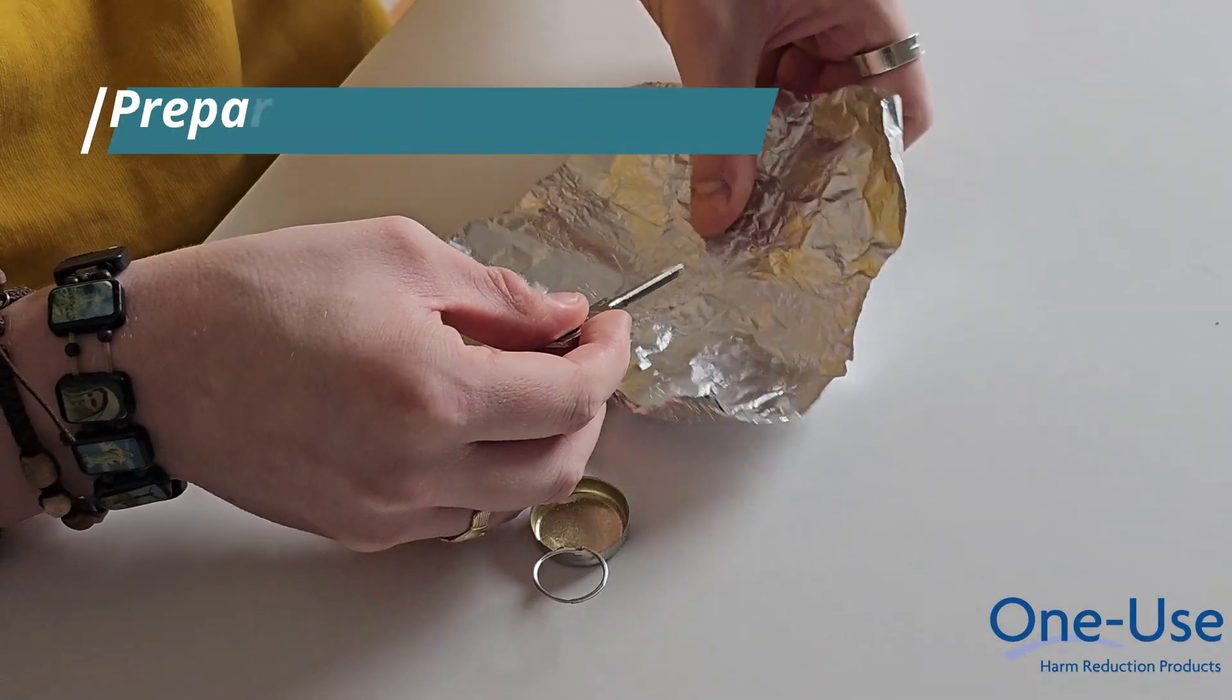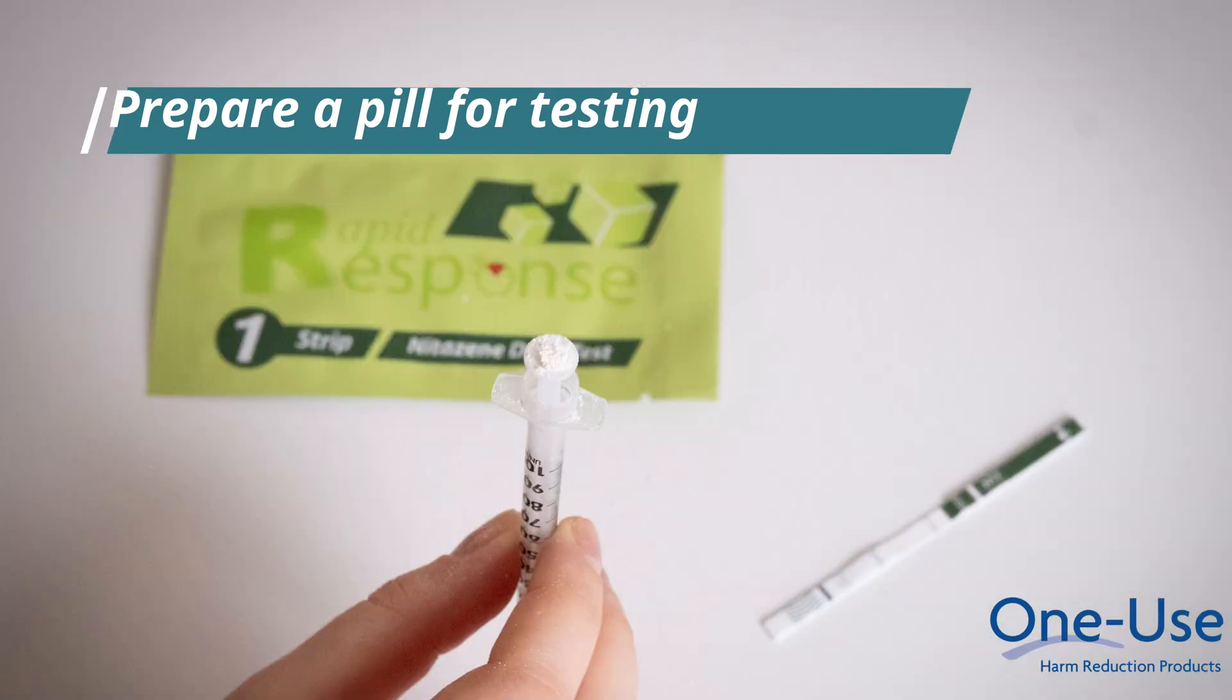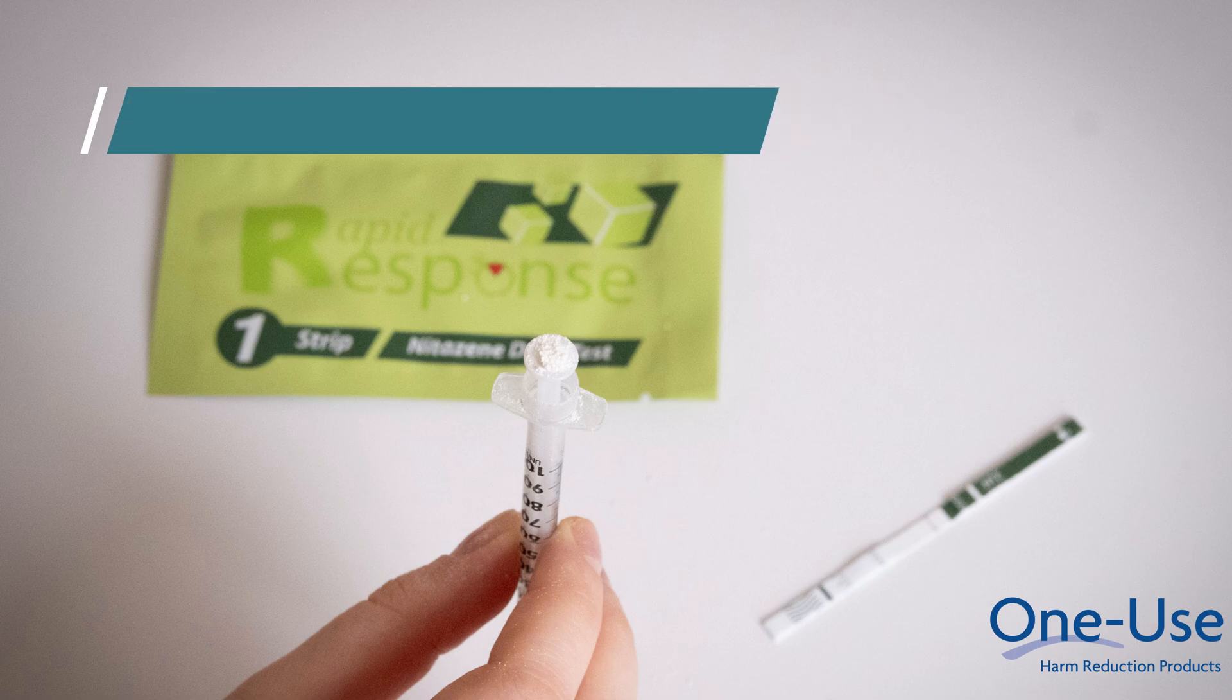Remove some of the powder using something like a tip of a key to scoop out the powder. You will need 10 mg of fine powder. For a visual reference, 10 mg is enough of the drug to cover the top of a syringe barrel.